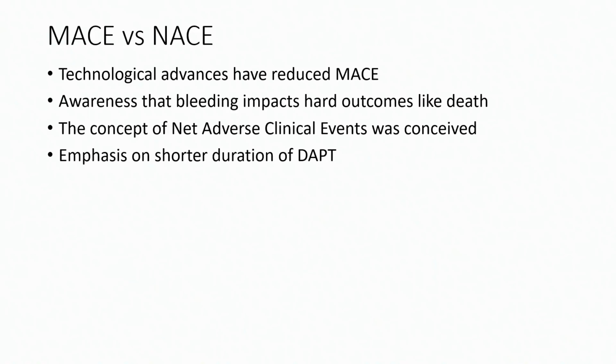So there is no doubt that technological advances have reduced the incidence of major adverse cardiac events. However, that has brought the awareness that bleeding is still significant and it still impacts hard outcomes such as mortality. And that's where the concept of net adverse clinical events was conceived, where they looked at not just the thrombotic events, but also the bleeding events, which lead to adverse outcomes. And with that, in the last few years, there have been multiple trials that have come out that have emphasized shorter and shorter duration of dual antiplatelet therapy in order to reduce the bleeding risk in these patients.